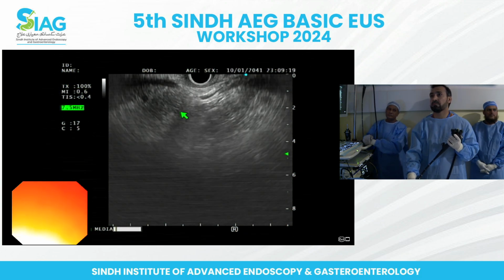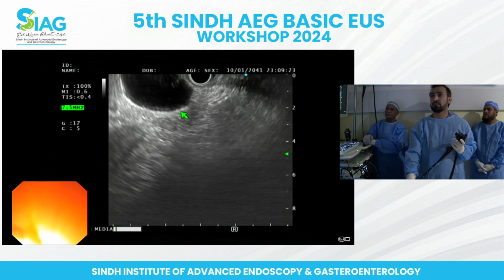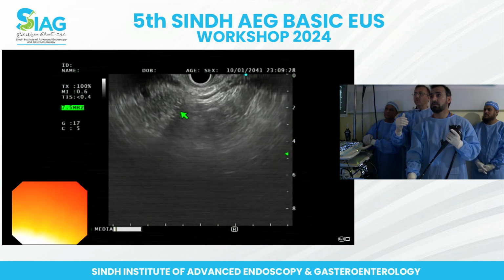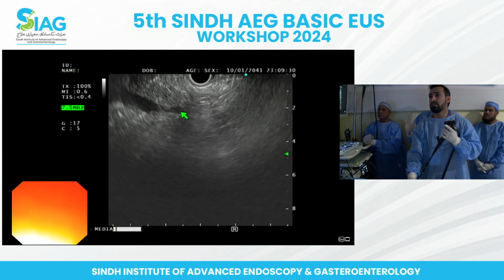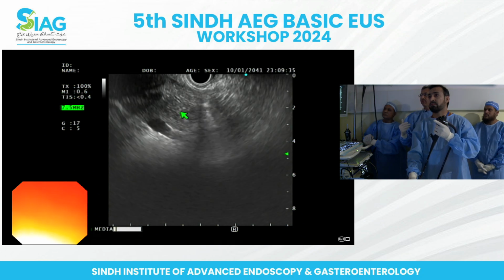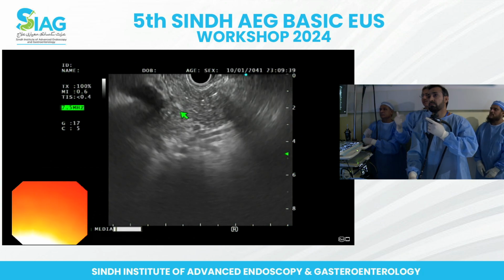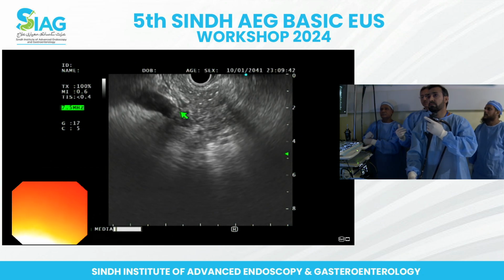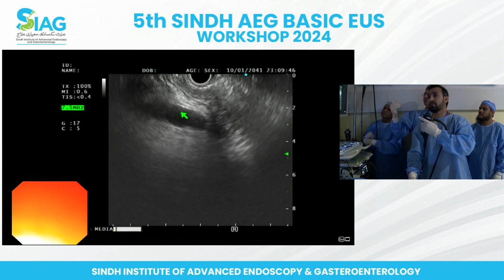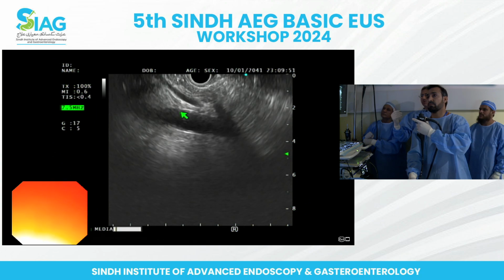So Dr. Mushtaq is supposed to show me portal vein. Okay, this gallbladder, if you've seen the gallbladder, that means that you've gone a bit too far inside. So you need to come back, and with a long scope you need to go back in. Okay, fine, we can see the portal vein. But it will be best that you come back and start all over again. Yes, good. So suction, and the way I'd shown you the portal vein. Probably you've gone too far in.